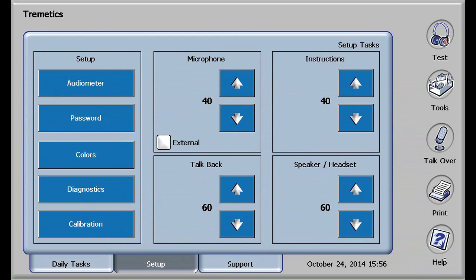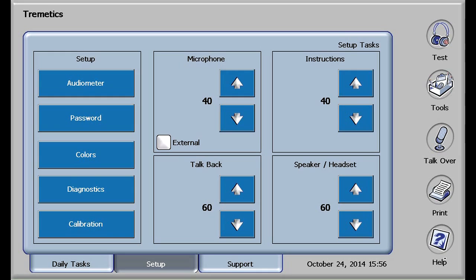Exit again will return you to the tool setup screen, where four more options are possible. The up and down arrows allow adjustments of the microphone for talk forward. The computer generated voice prompts can be adjusted with the instructions key. The internal monitor can be adjusted with speaker headphones, while the talk back microphone, if connected, can be adjusted with talk back. I recommend a starting level of 60 for each.